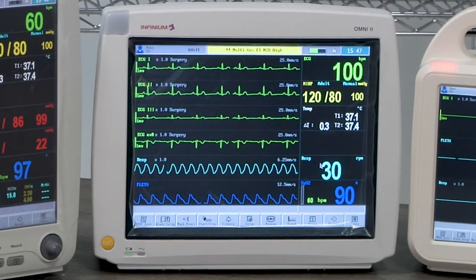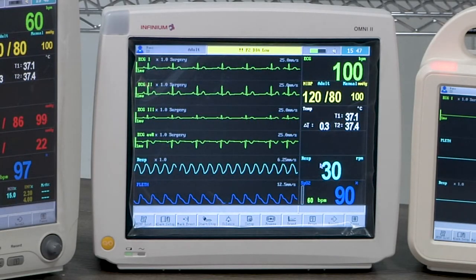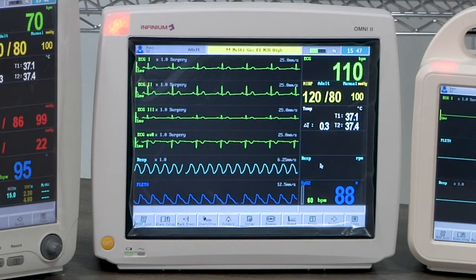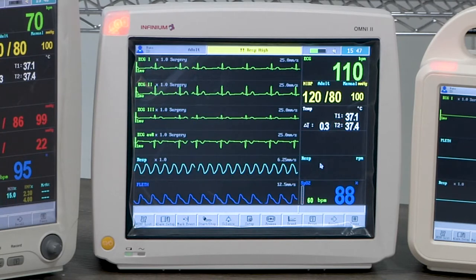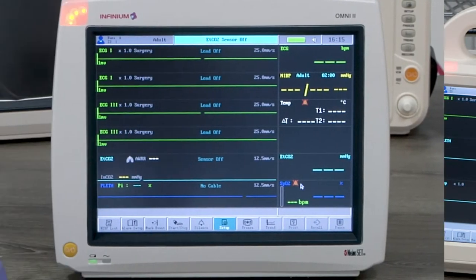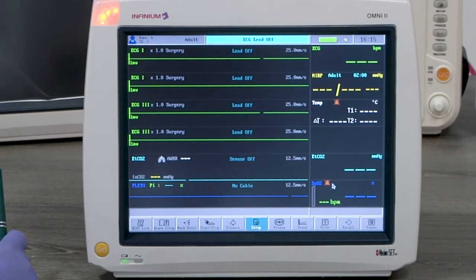In this video we'll demonstrate how to use the Infinium patient monitor Omni 2. First let's go over the general settings.